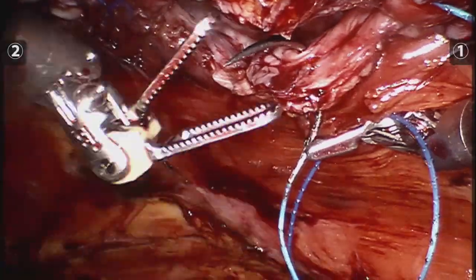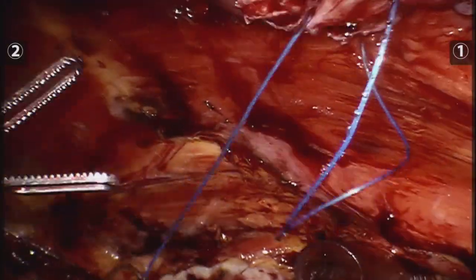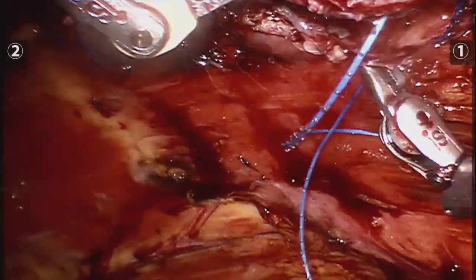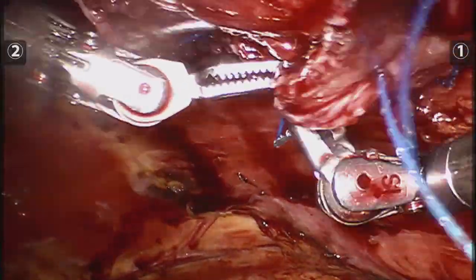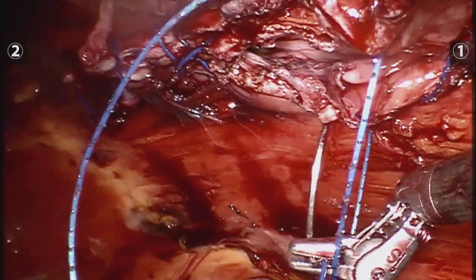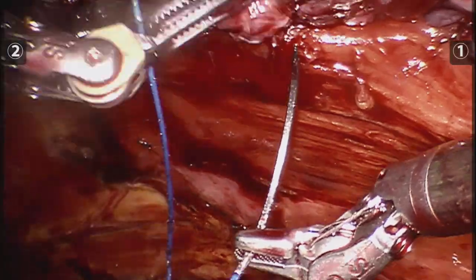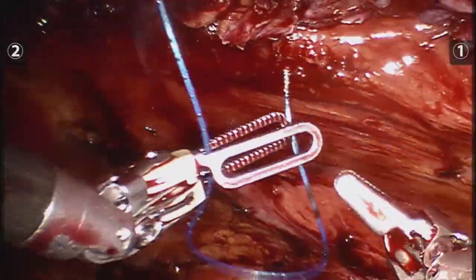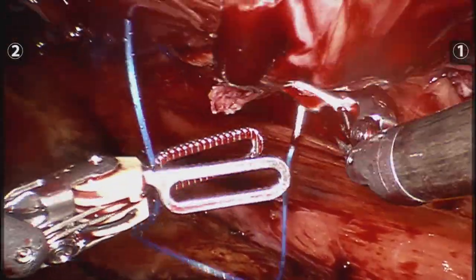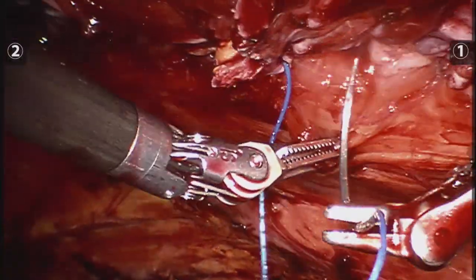As we progressed we're finally getting almost to the end of the surgery. I closed the defect and then came back on the same line of suture just to make sure it didn't get loose, always double-checking that the line of closure is nice and tight and that there are no gaps or loose areas where a further hernia can develop.